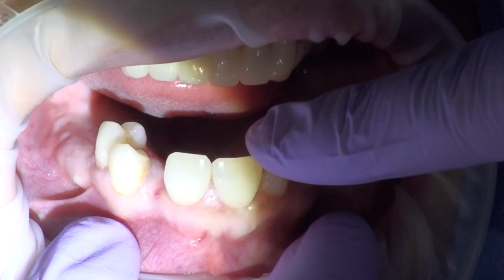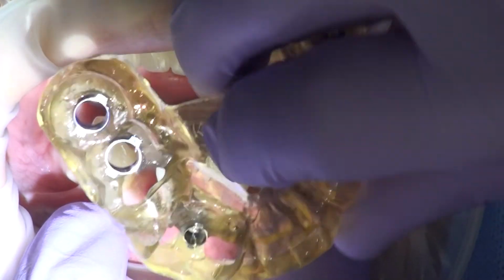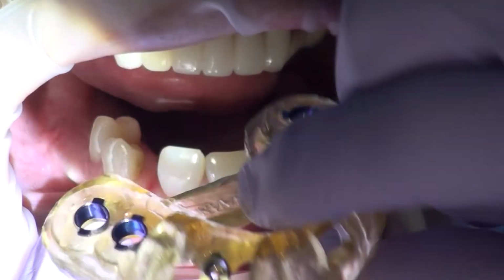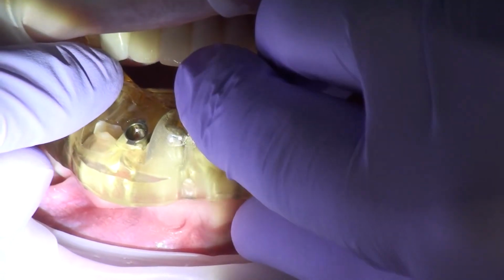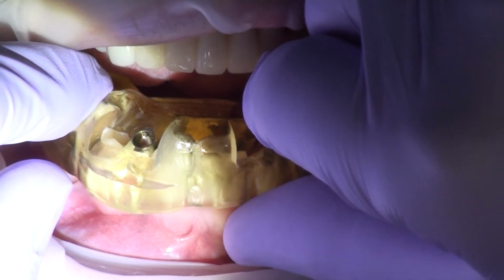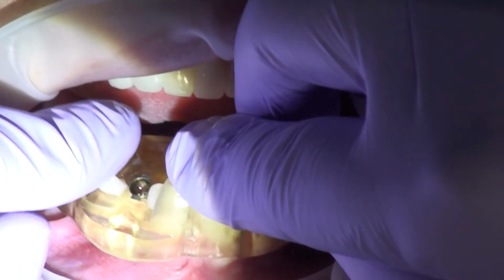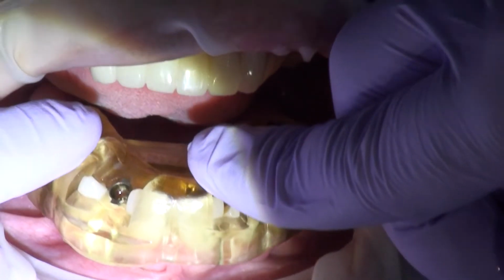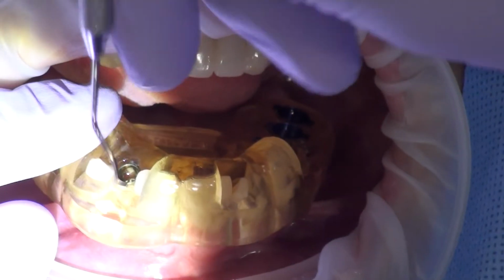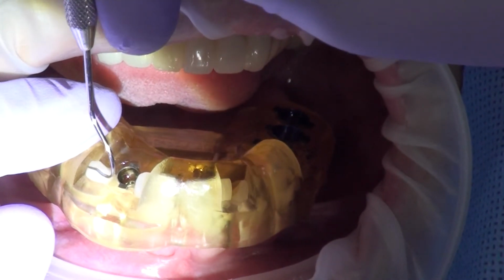The first thing we're going to want to do on any case is to make sure we try our guide in and it fits properly. This is always an exciting thing because if this guide doesn't fit just beautifully, we can't start with our surgery yet. So I'm going to go ahead and roughly seat it, and then once I feel like we're lined up, I'm going to put some good pressure, and this one literally clicked into place, which I will take. And then my eye likes to look right around here. Make sure it's sitting nicely.